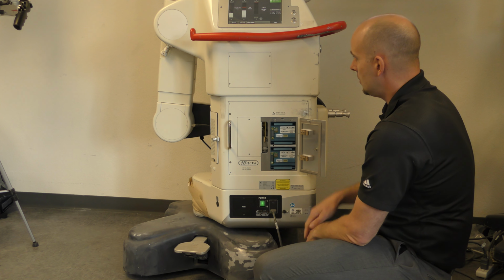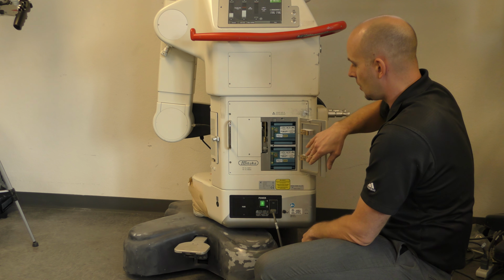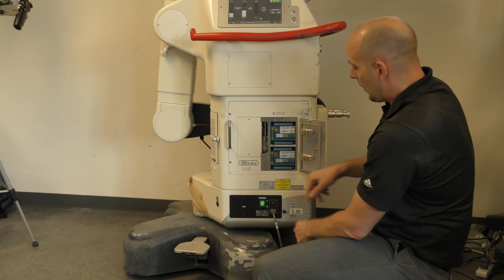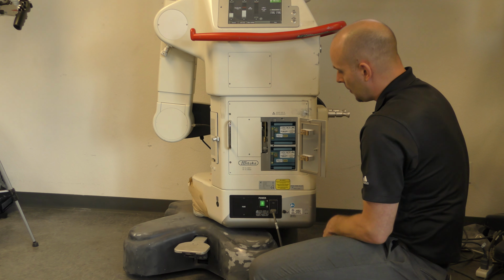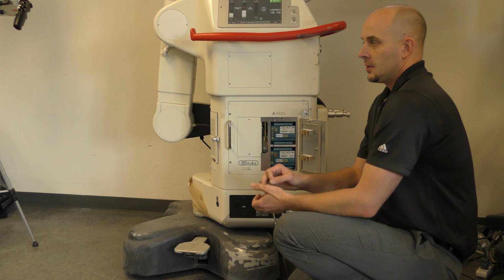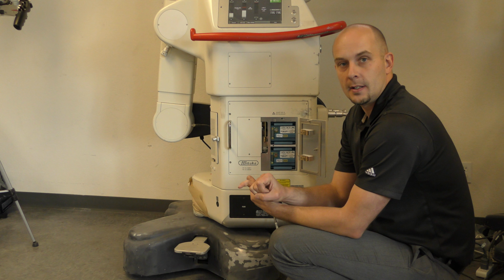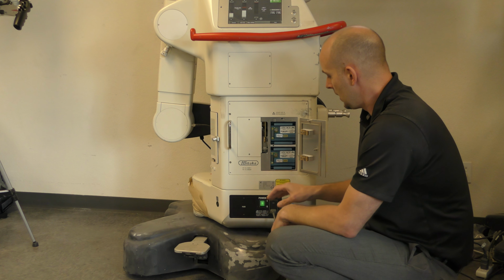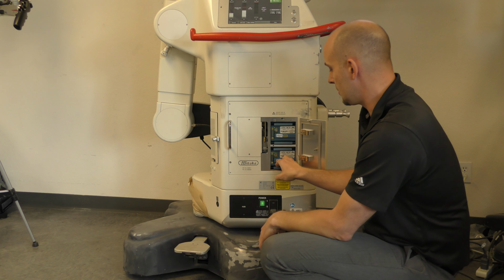So the first thing I do is, before I turn the unit on, I will pop this door after I've checked the brake and the casters. I will check the bulb timers. In this instance, both of these bulb timers are dead. So I have a 3-strike system. That's my first strike. If I see the bulb timer is dead, it means that it's been in there long enough to where the battery is dead now. I still don't know how many hours are on these individual bulbs.